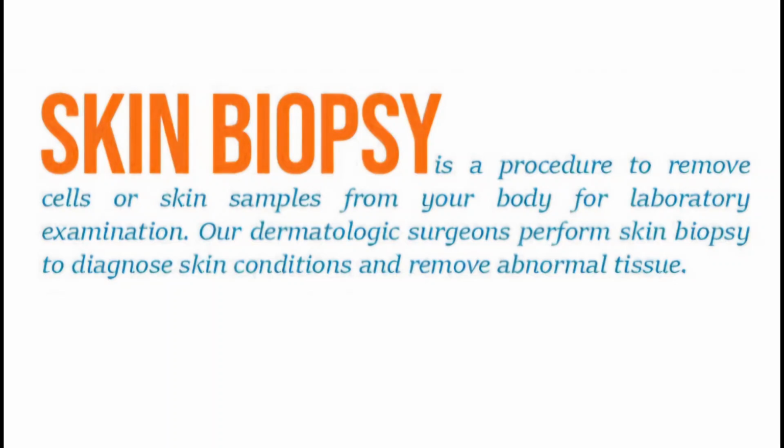Dr. Arshad Mahmood here. In this video, we will discuss skin biopsy: why it is performed, what its types are, and we will briefly see the procedure of skin biopsy practically performed on a patient. Skin biopsy is a procedure in which we take a sample from the skin and analyze it histopathologically for different diseases. Its indications are very vast.